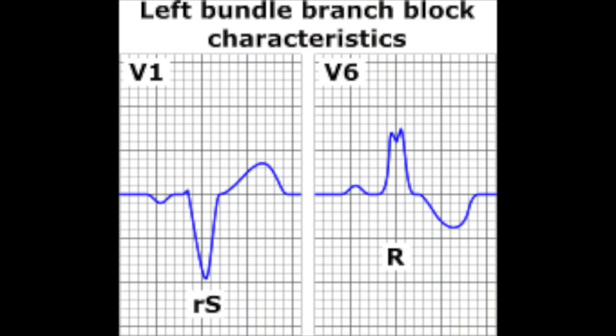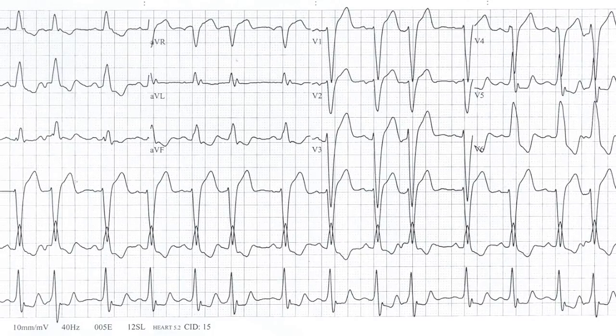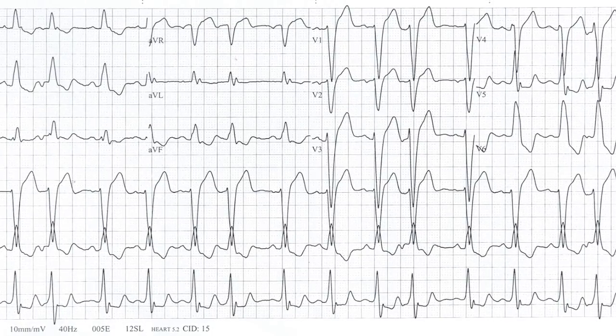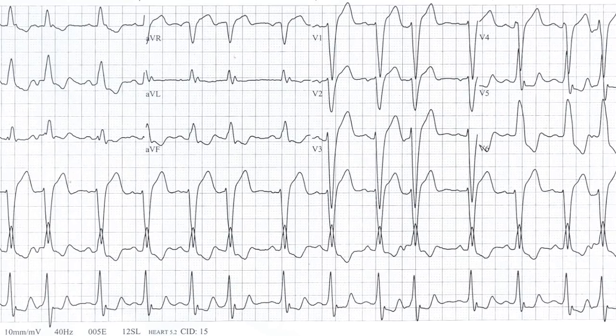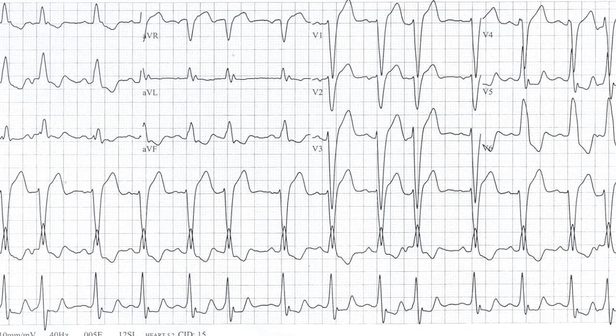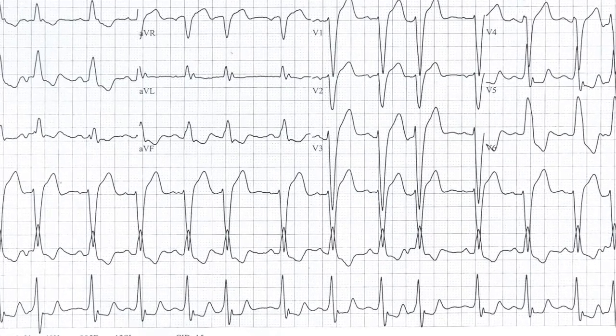Some common things you'll see with a left bundle branch block are in V1 and V6. In V6, you will see the two bunny ears, which make a wide QRS greater than 120 milliseconds. In V1, you'll see a little R and a huge S. This is a great example of a left bundle branch block — you see the bunny ears in V6, the huge S in V1, and widened QRSs in many of the other leads. But you can also see some ST elevations as well, which can be confusing.